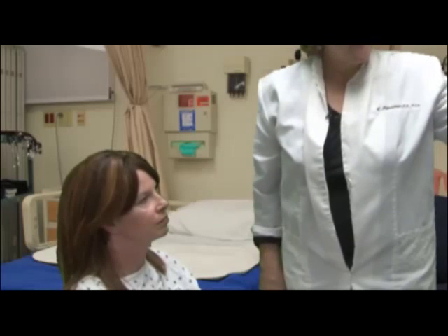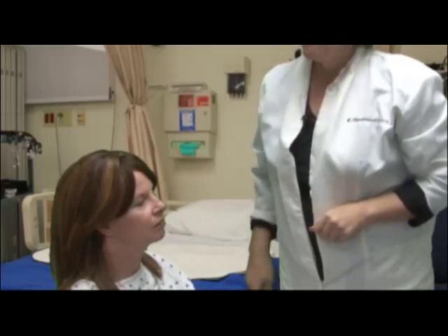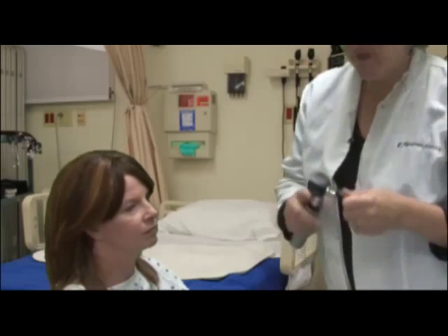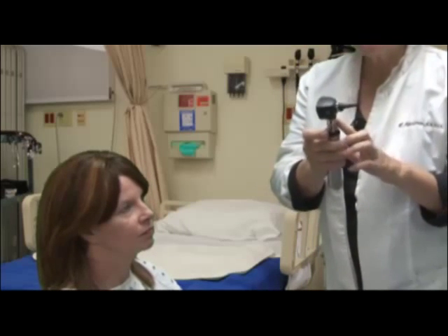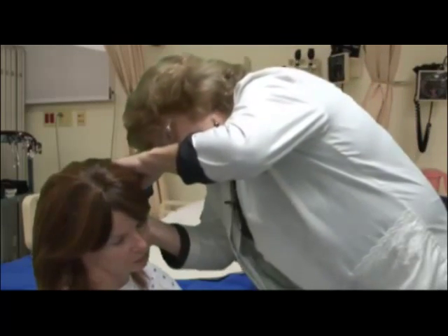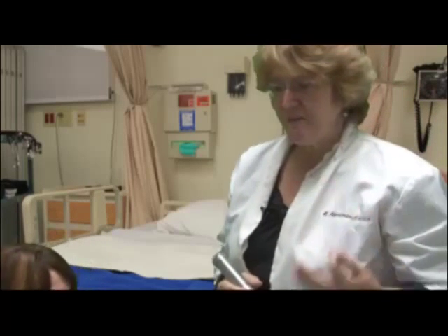Please look to the distance. Now look at my finger. And accommodation, that's the only test you're going to do for the eyes. The other thing you're going to do is put your otoscope together, and you're going to look in the ears on both sides and see that the tympanic membrane was gray with a positive light reflex bilaterally.